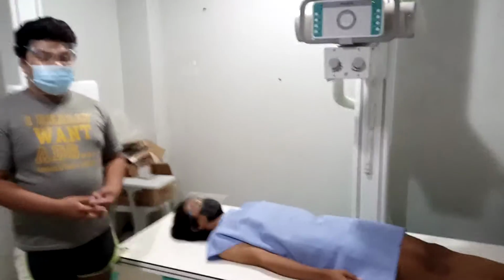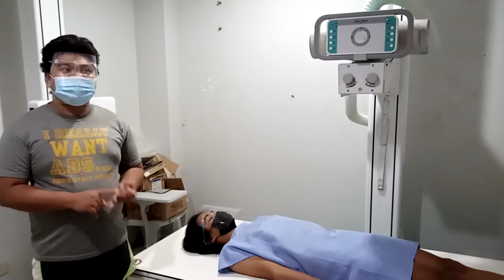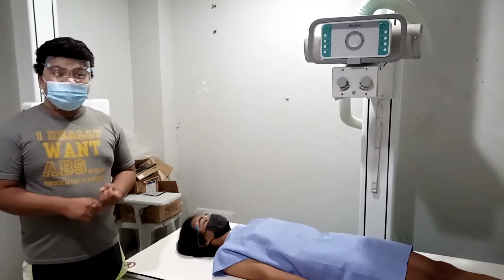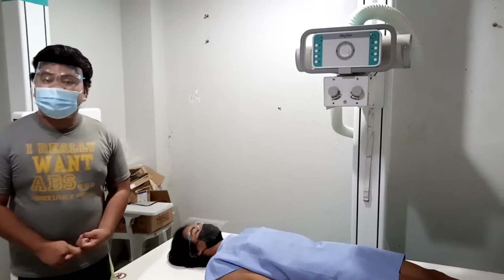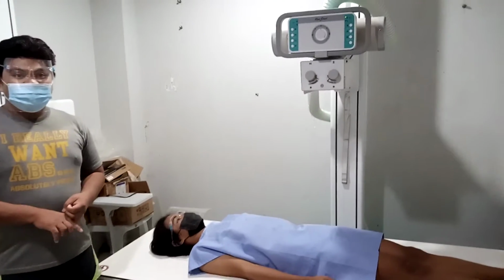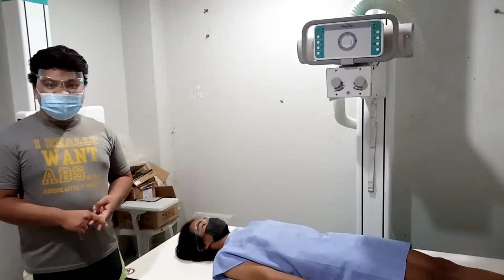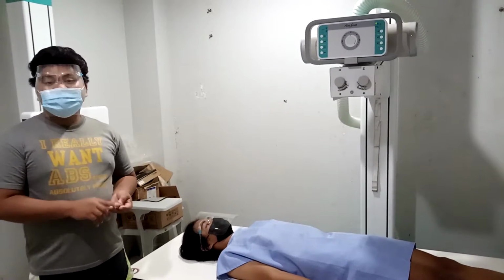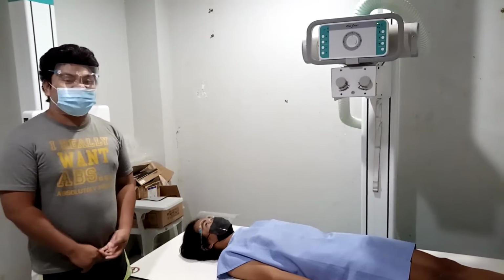Today we're going to demonstrate the cervical vertebrae, AP axial and lateral position or lateral projection, or Grandy method, the thoracic vertebrae, AP projection and lateral projection, and lastly the lumbosacral vertebrae, AP and lateral position.